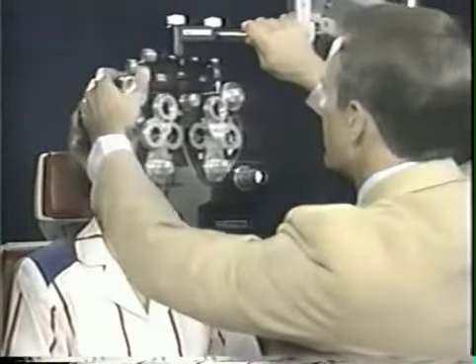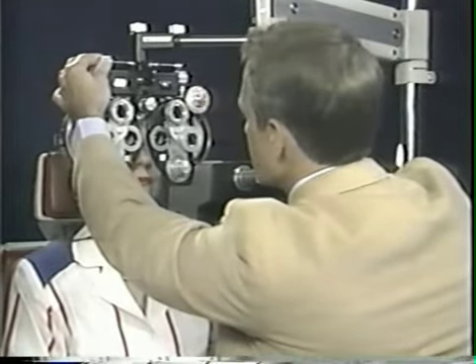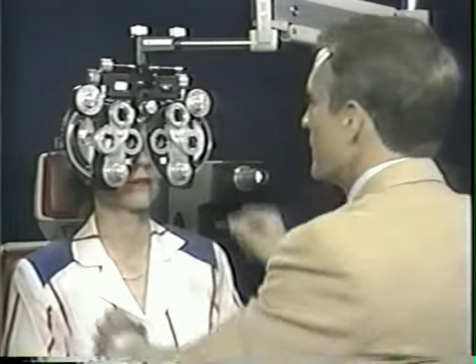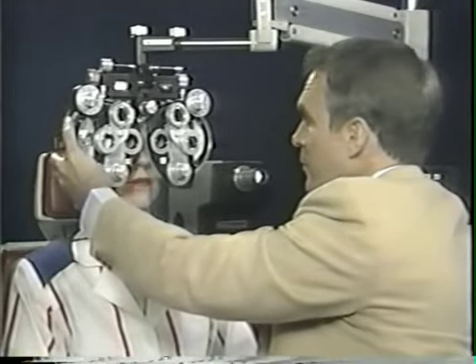Subjective refraction, the procedure of using responses from the patient to determine the refractive correction for the eye. Trial and error or alternate choice techniques are applied in a step-by-step process, with those patients old enough and cooperative enough to respond, to arrive at the best optical correction.